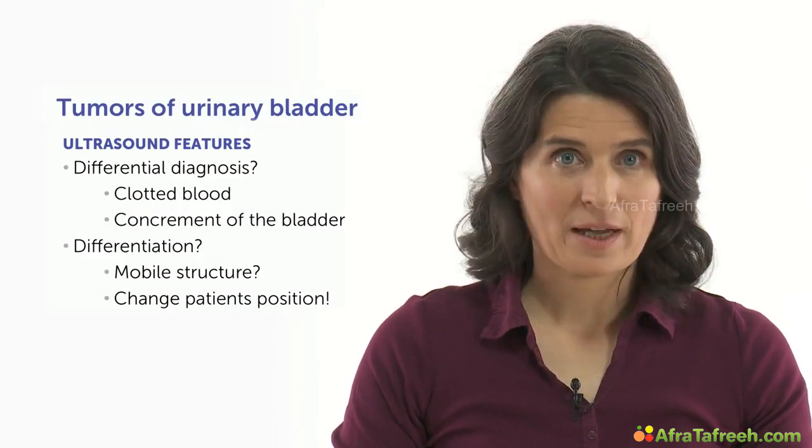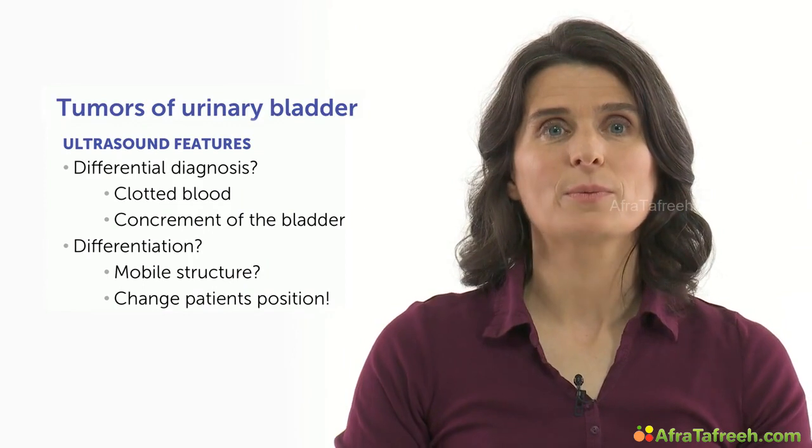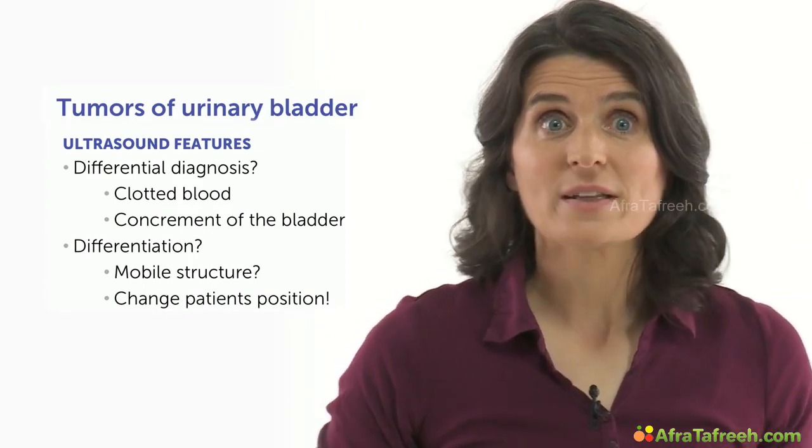Ultrasound can help detect pathologic changes of the urinary bladder wall when the preconditions are good and the bladder is reasonably filled. When we find any tumor of the bladder, further investigation is needed anyway. But there are a few differential diagnoses we can exclude during our ultrasound examination. Sometimes clotted blood in the bladder or a bladder stone can look like a tumor. So what can we do for differentiation? This is quite an easy matter.